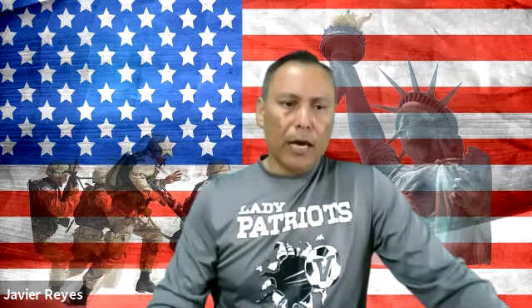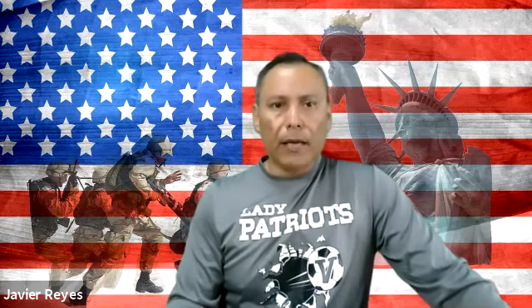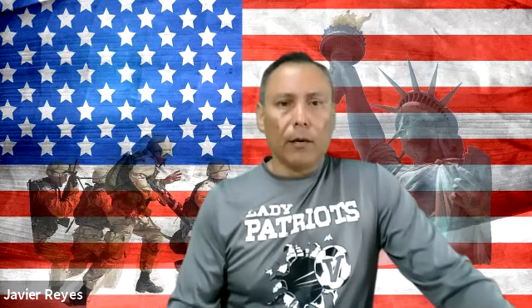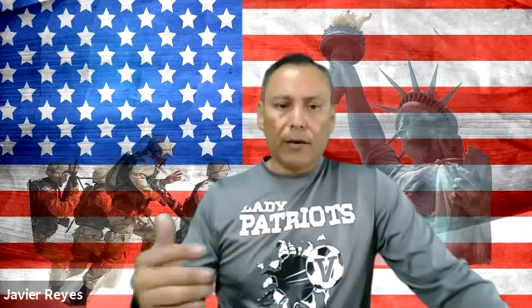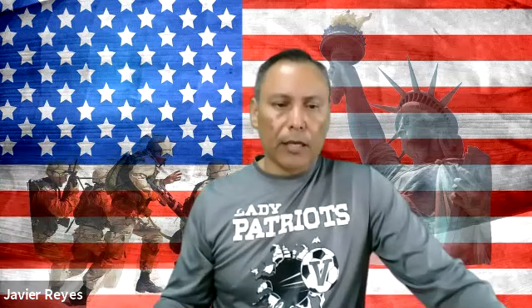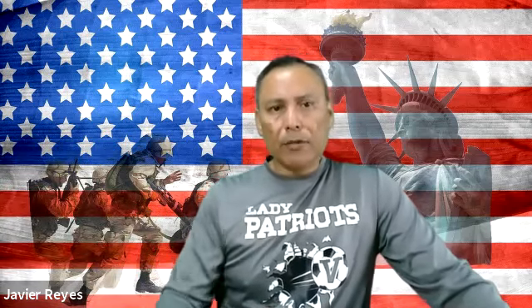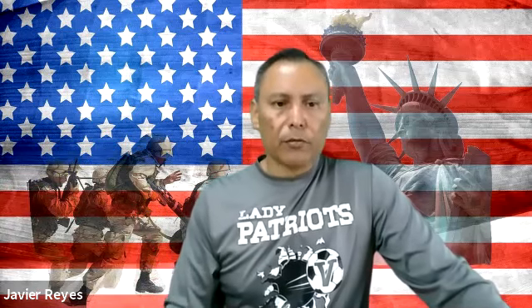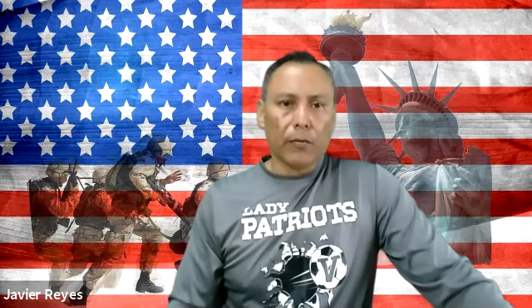When these tubes are brought into the lab, or let's say you work in a laboratory that is not close to your main lab, let's say you're a mobile lab and you're in Bronzeville and you collect your first samples at 6 in the morning, and you have other tubes to collect. By the time you're done, it's going to be 9 or 10 in the morning. What happens to those first tubes? They're going to start to hemolyze or clot. So what do you do?